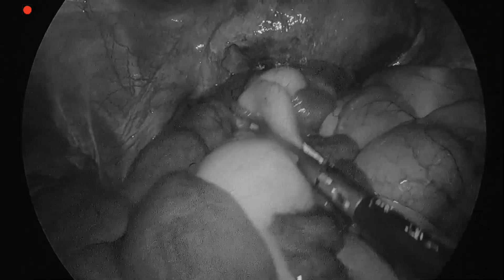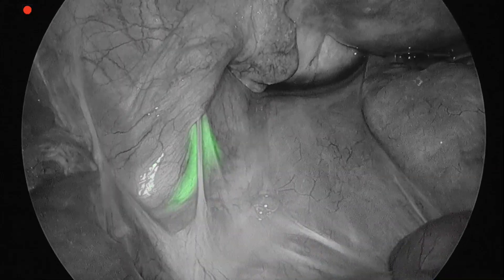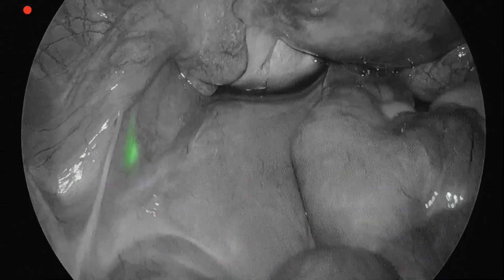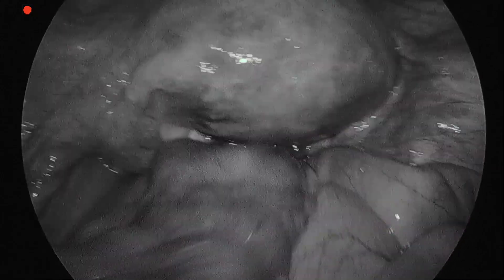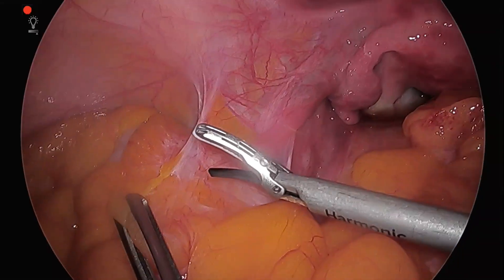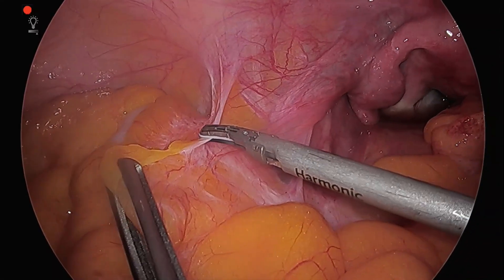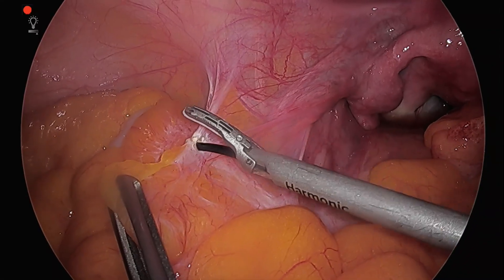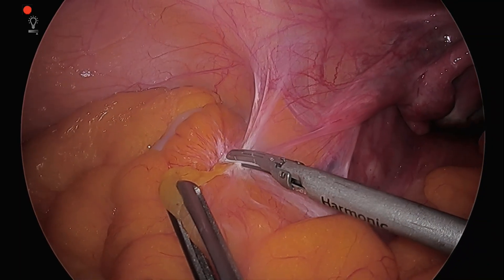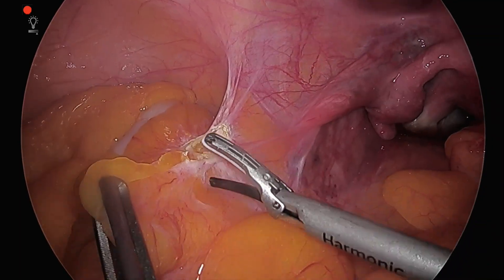Now we can see in the ICG mode the ureter, which is clearly visible. At just the click of the camera, you can see the ureter throughout the surgery. Now the sigmoid adhesions are released.